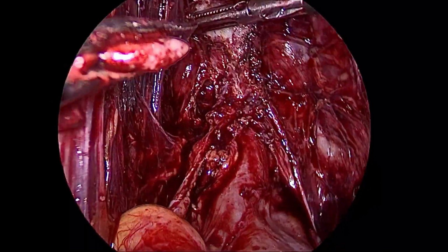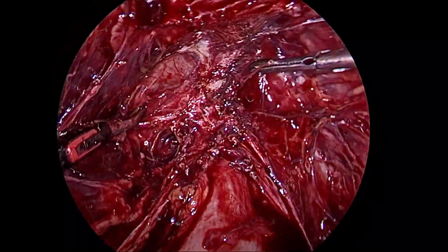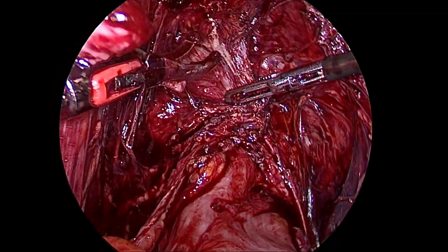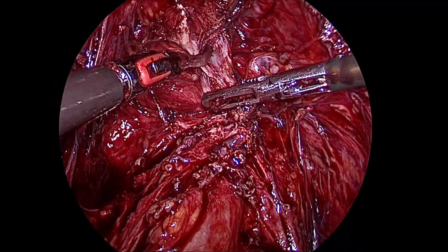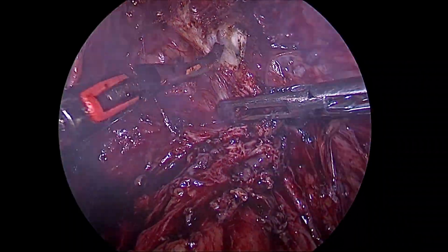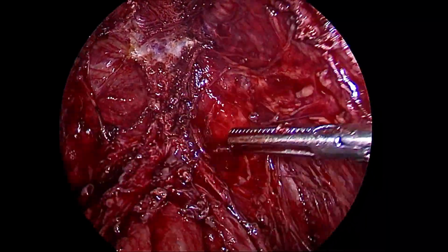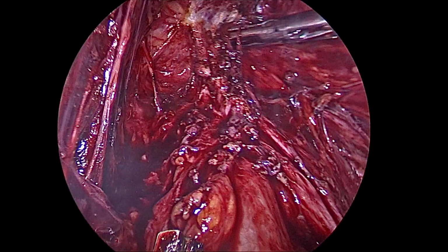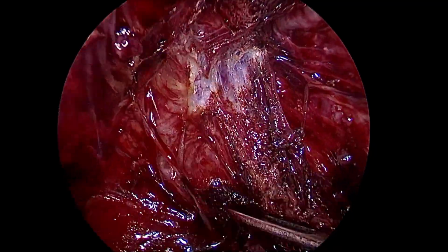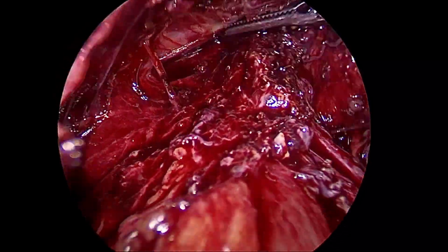Now here, as you can see, the bowel is completely gone down. The POD is nicely seen, the Denonvilliers fascia is dissected well, and the bowel is completely out of the picture, out of the POD into its normal position. Here whatever smaller fibrosis that is there, that also we are dissecting and pushing into the normal position, thereby ensuring that the POD is nice and clean.